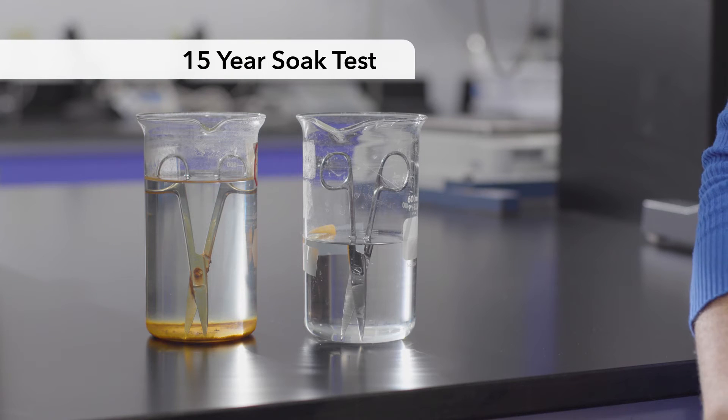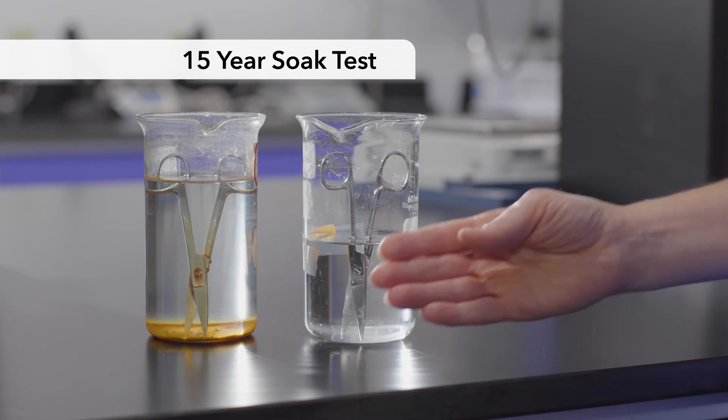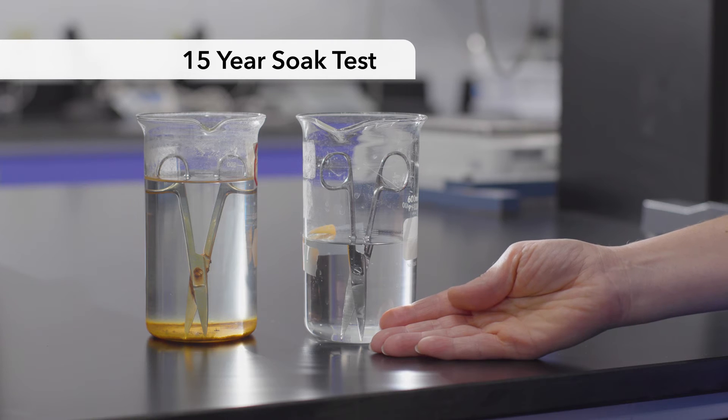To show you just how well Prolistica chemistries protect, I have scissors here that have been soaking in Prolistica for more than 15 years, since 2007, and you can clearly see that even after all that time, the chemistry has prevented damage to the scissors.